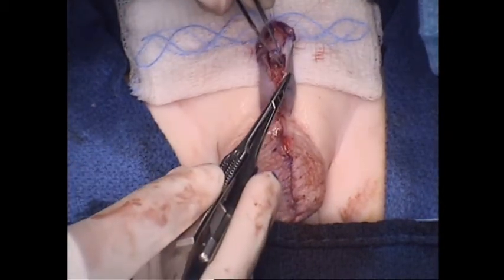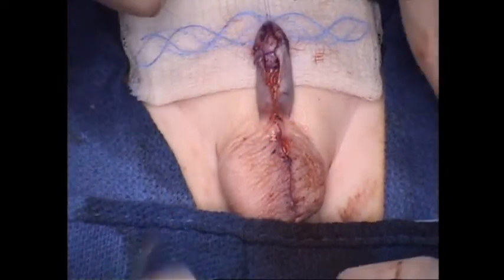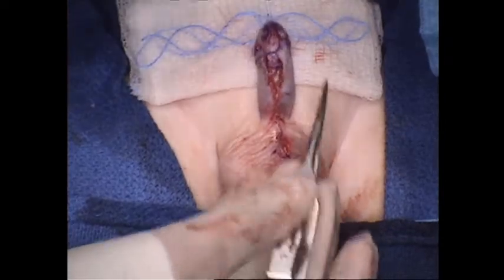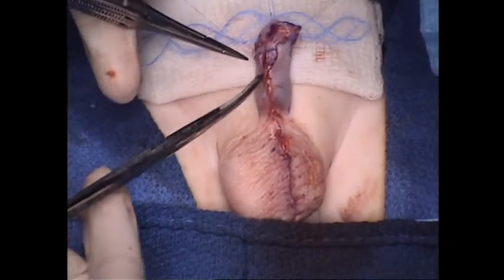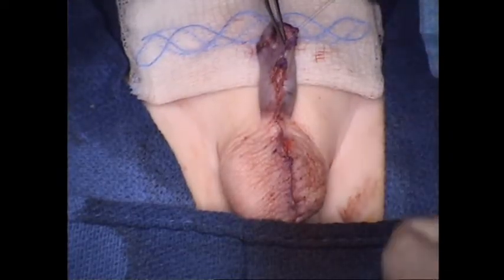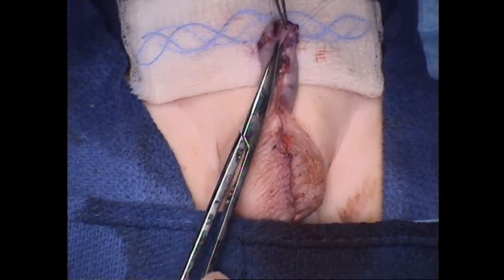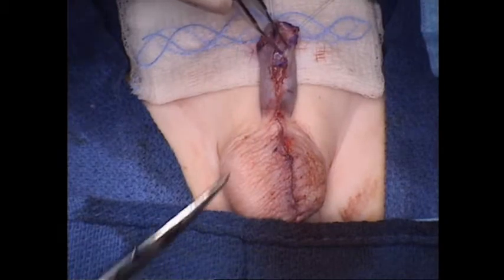I'm in the meantime going to put in our stay stitches for the glans right at the corona on each side. This is 6-prolene, and this will become part of our tie-over bandage after we put the graft. So we'll leave these stay stitches long enough to tie in a few minutes. And this holds the glans wings open for us, so that again, we make sure that the graft that's within the glans is wide enough to make a normal caliber neo-urethra at the second stage in 6 months.